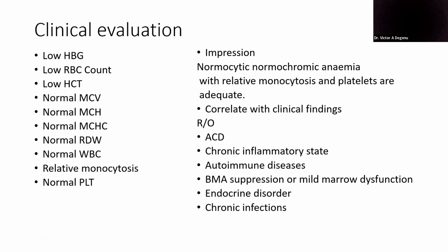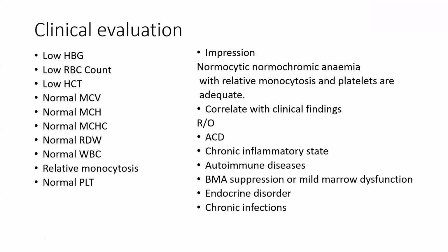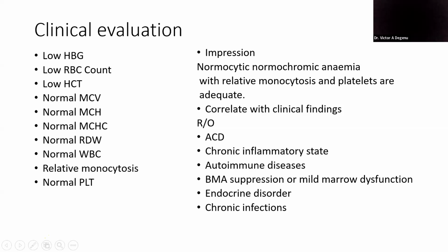Monocytosis may also appear as part of the marrow response to the environment. The relative monocytosis could also be as a result of the marrow's response to the environment. So that is it.